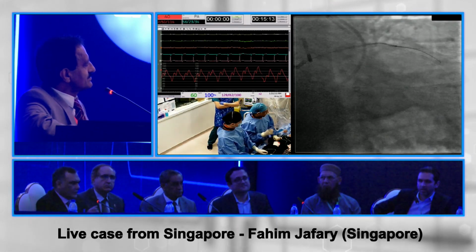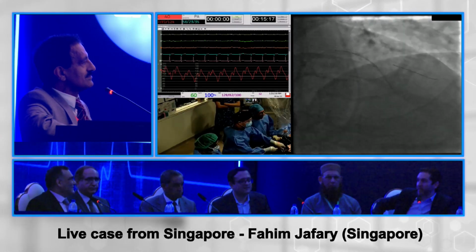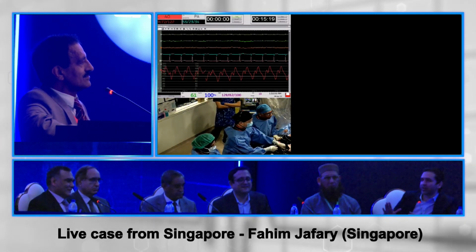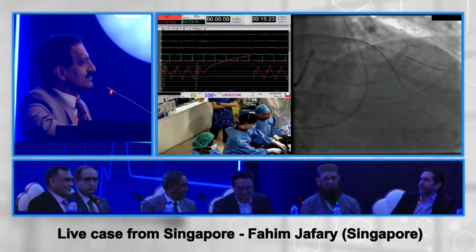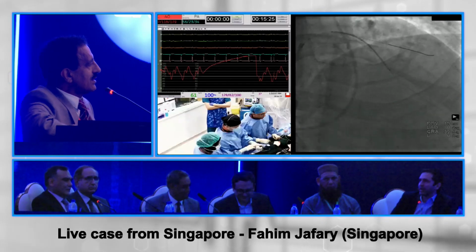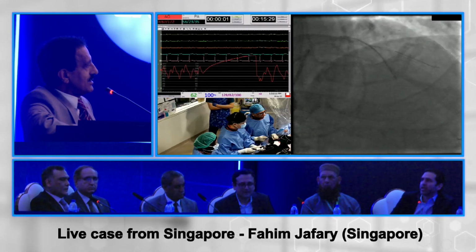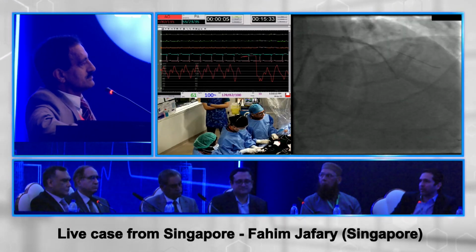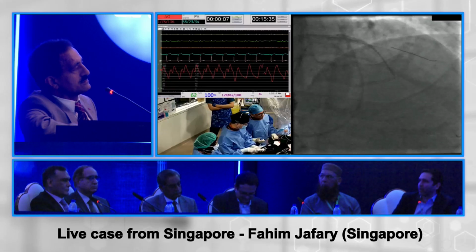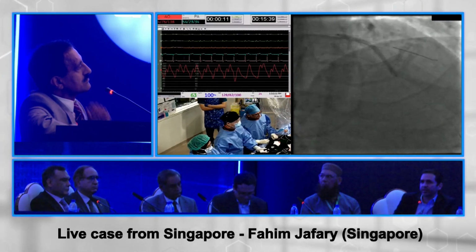I just worry that in a calcified vessel, somehow the balloon could get caught in the stent and rip the stent apart. I think it's very popular in our stent WhatsApp group, and it's good that you use that technique, but I just think it's not worth it. It's not endorsed by any guidelines or good data behind it right now, and you can have a lot of issues with a jailed balloon in calcification. Ashok, I would have gone with the two-stent technique in this strategy. It meets all the definition criteria for a complex lesion, and I would have preferred that.